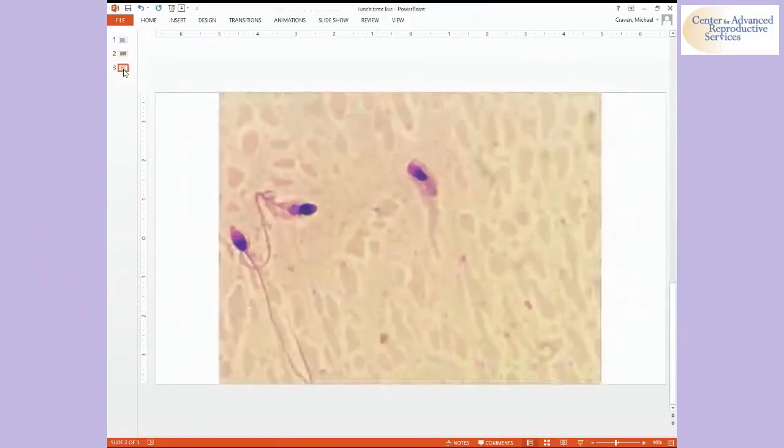And then here's a picture of what a morphology looks like. These are dead sperm that are stained, and we stain them to show the acrosome of the sperm and then the tail, because these cells are so small that they're really clear. Staining them allows you to view the morphology in a really holistic way. Excellent. Very cool. Thanks for sharing that. Having that visual really made a difference.